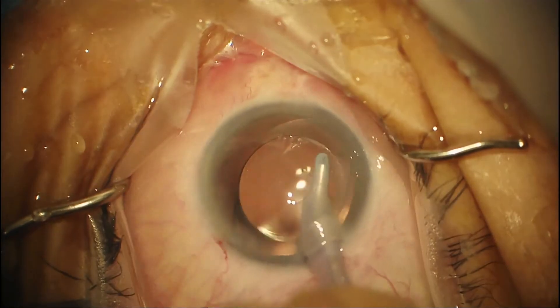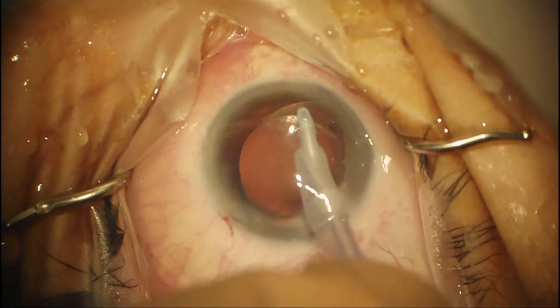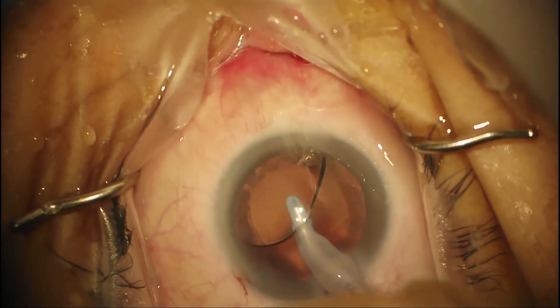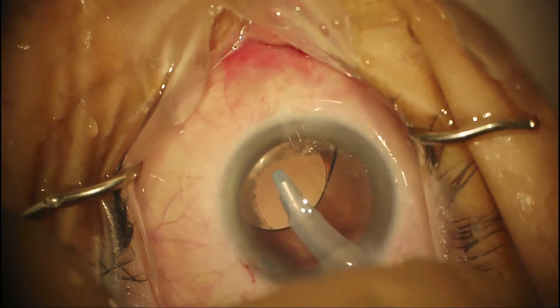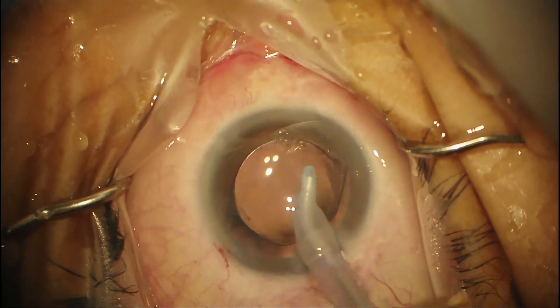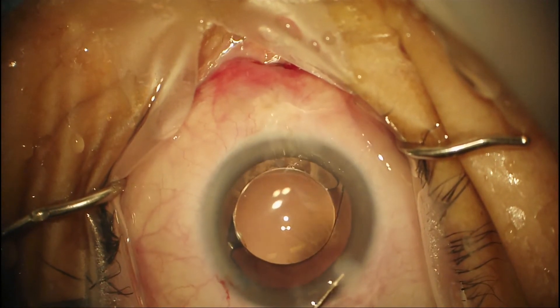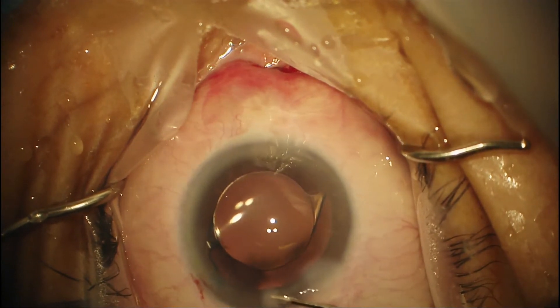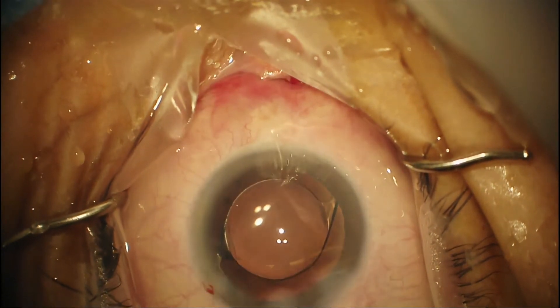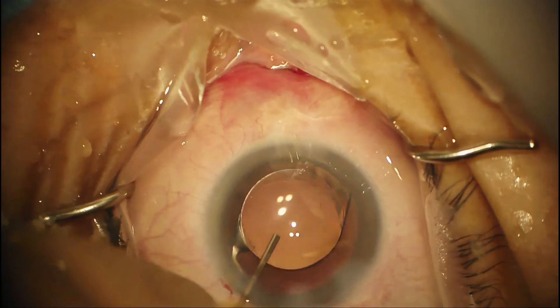The orientation of the haptics is not terribly important, but if your rhexis is not 100% overlapping on the optic, you want to center it as well as you can and perhaps put the haptic in the area where there's not as much capsule overlying the optic. Now getting all the viscoelastic out of the eye — I'm going to go underneath the optic to make sure all the viscoelastic is gone. This is fairly easy to do with a silicone handpiece. It looks like we have good rhexis coverage and the lens is in good position.